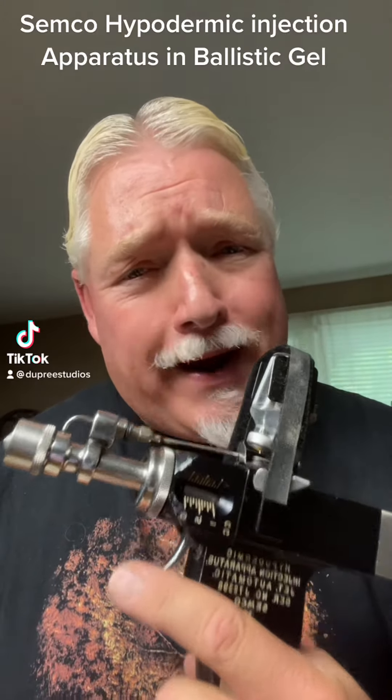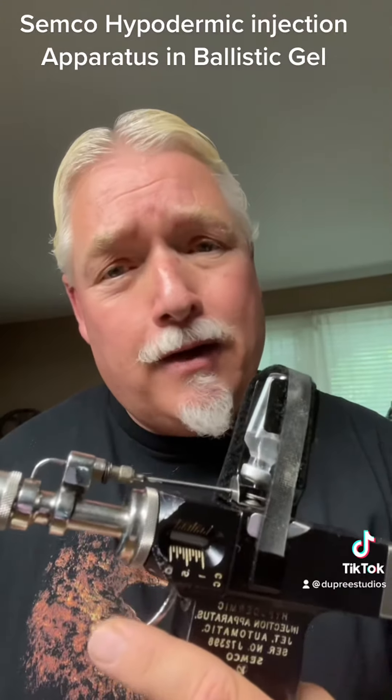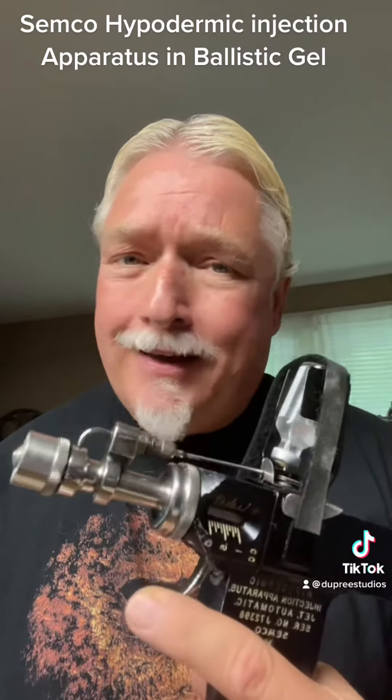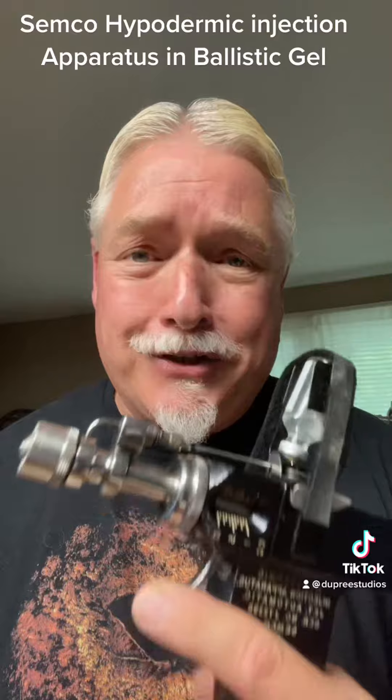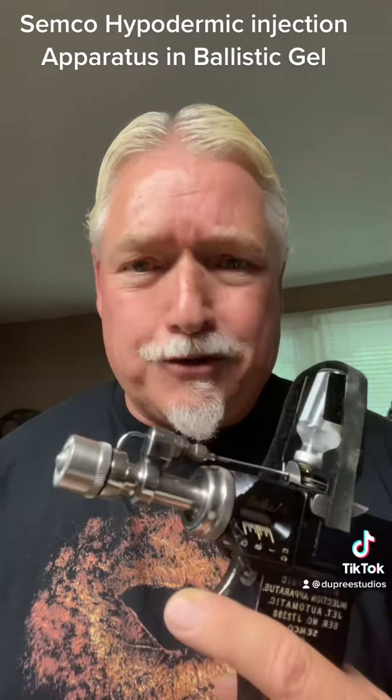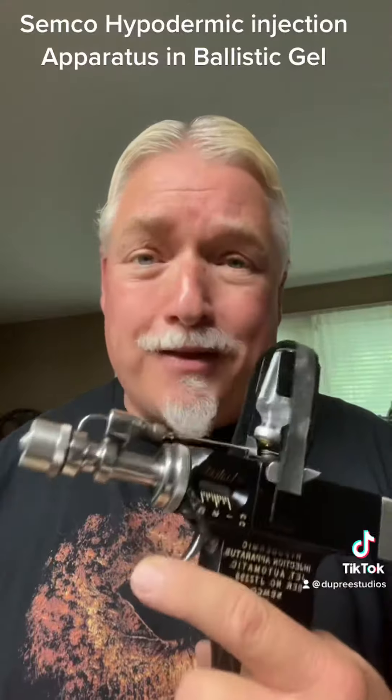Now the time you've all been waiting for — the Semco hypodermic injection apparatus shooting into ballistics gelatin. We're also going to do a typical syringe to show you the difference between the both.